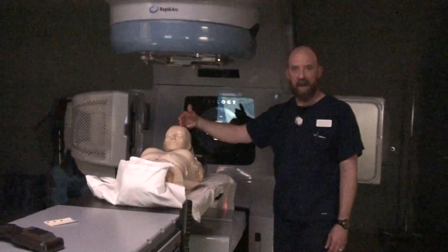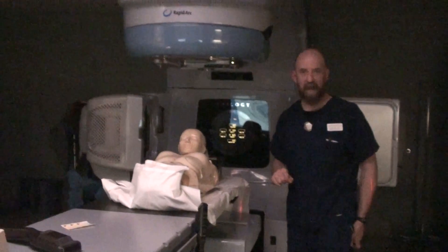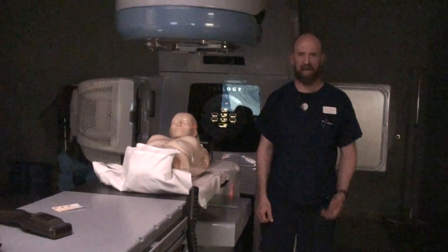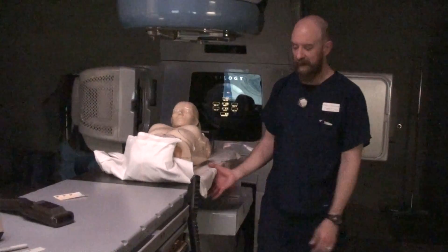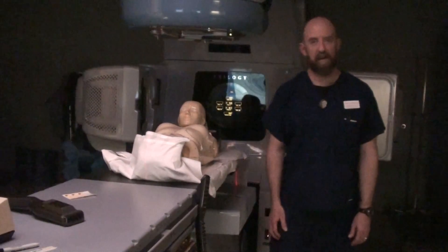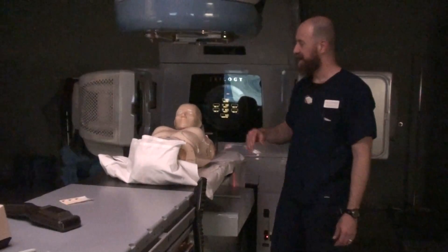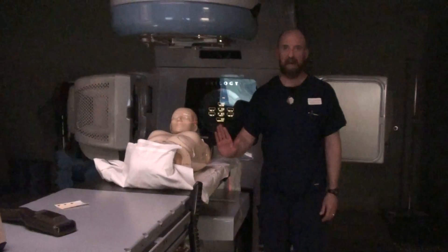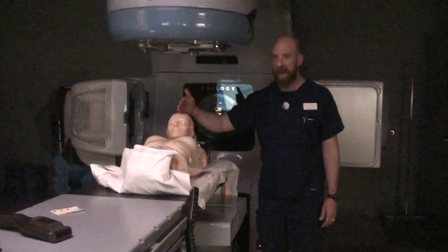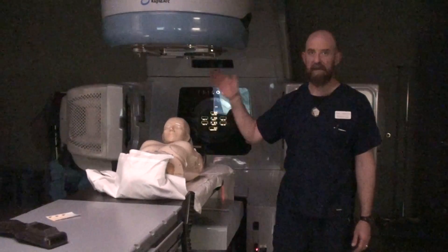Let's pretend that you forgot to move the patient left/right when messing around with the lateral canthus BB. So you rotate to the anterior, you go out and fluoro, and you realize you're looking above the eye — you need to be right in the center. So on fluoro, you move the patient laterally until you're centered, then call the doctor. The doctor will come in and may move it, say, three millimeters. Now your lateral has changed, but your in/out and up/down have not.